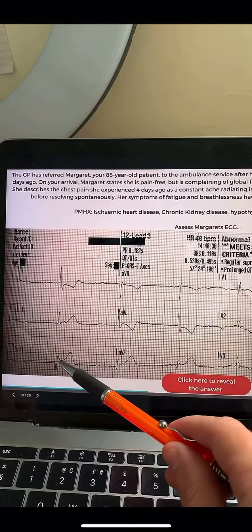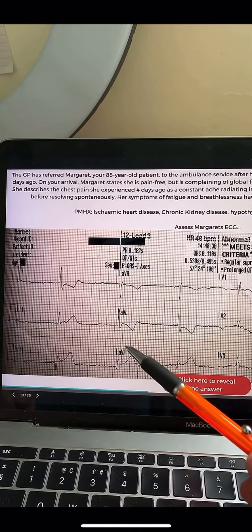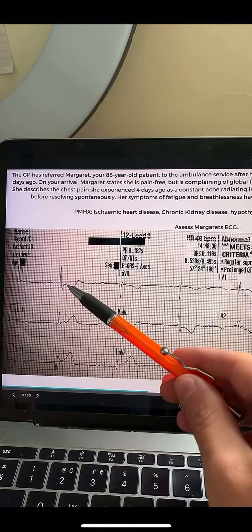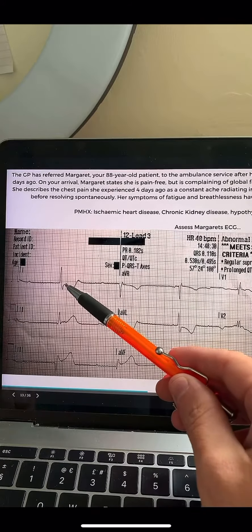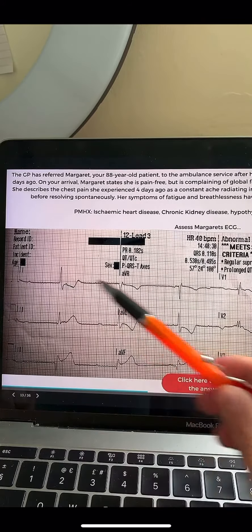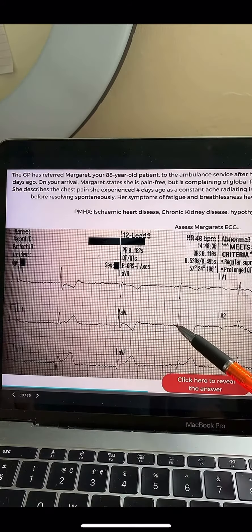Here's some ST elevation in two of the inferior leads, and here's reciprocal ST changes in lead 1 and in lead AVL.